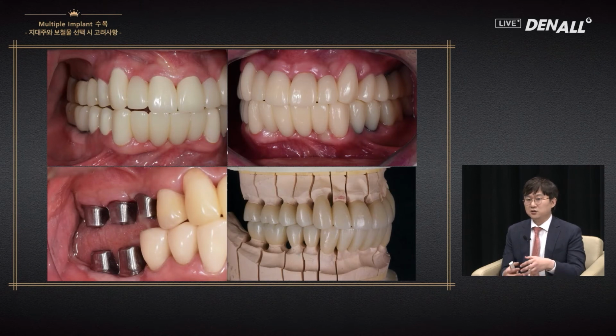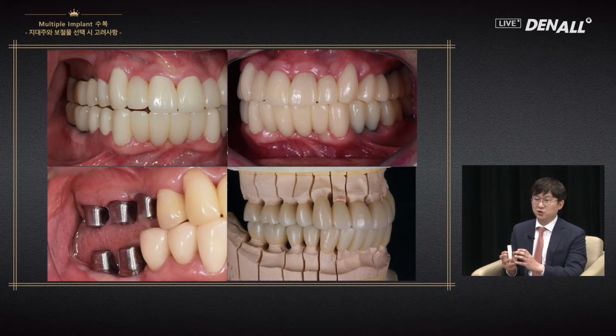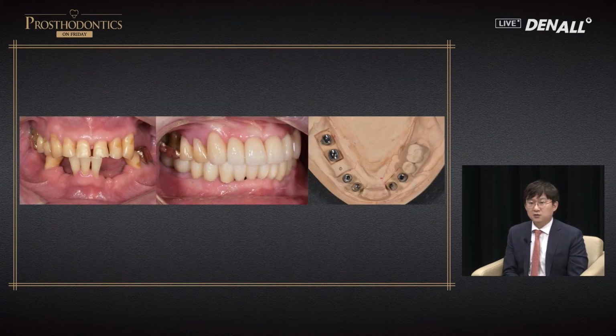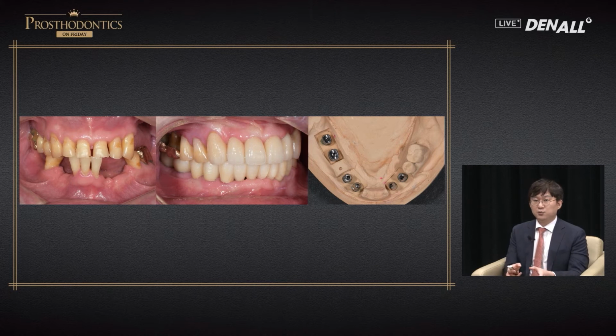Next, custom abutment can be used like this. If it is a mixed dentition with natural teeth and implants, a temporary is made like natural teeth. An impression is taken for all of them together without coping like abutments. And for the final prosthesis, custom abutments can be used like this. In a multiple implant prosthesis similar to the one before, temporary is made easily and impression is taken and transfer is made easy. Custom abutments can be used like that.